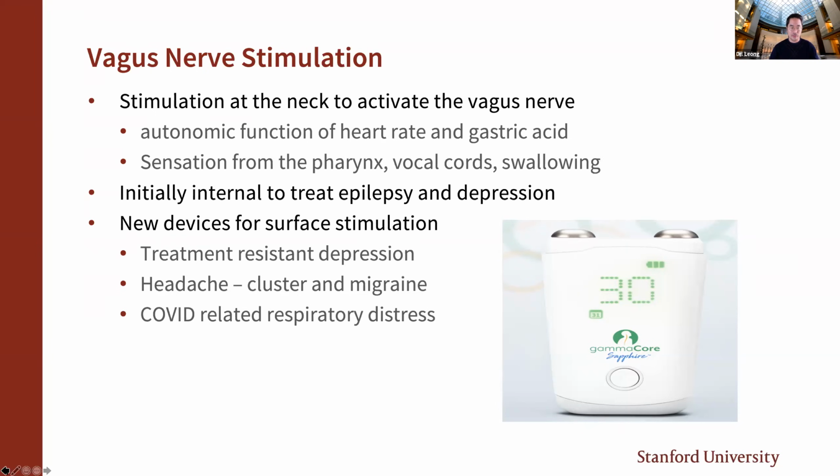And so at very, very problematic parts of COVID, when someone is almost ready to go into the intensive care unit, or maybe in the intensive care unit with respiratory support, you can use this vagal nerve stimulation in order to decrease the amount of problems that are being developed by COVID itself. And it actually has an FDA order that it would be allowed in those kinds of circumstances.